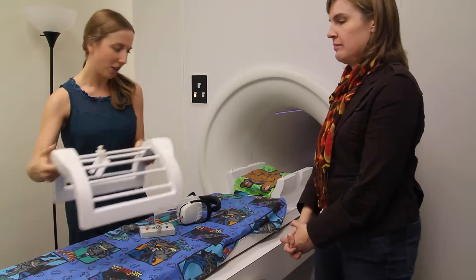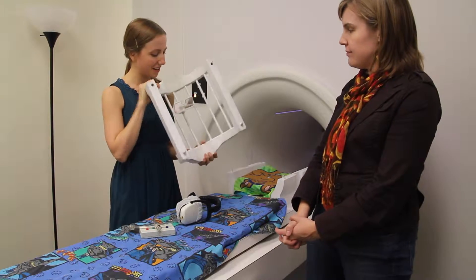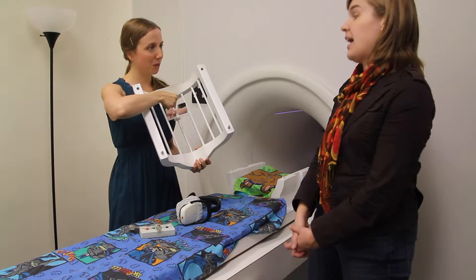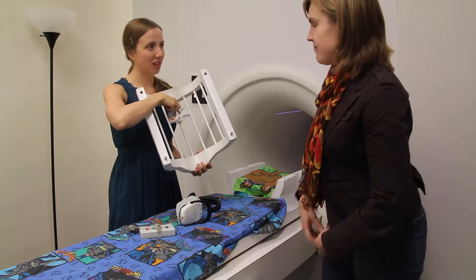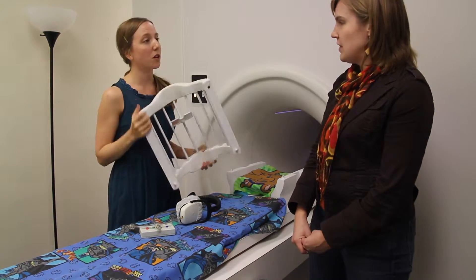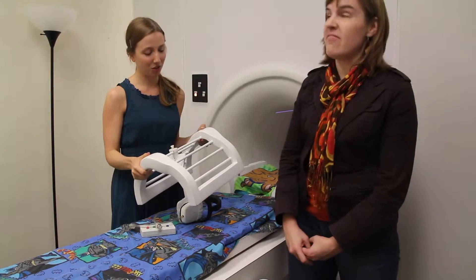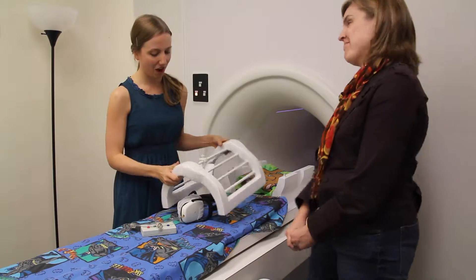The way that you get to watch the videos is you're going to have this special mask. It sits over the top of your face, and it has a little flip mirror in it. You see this funny curved piece? That's where your nose goes. So the mirror is going to be right above your nose, and that's where you're going to be able to see your movies or your computer games that you're playing.